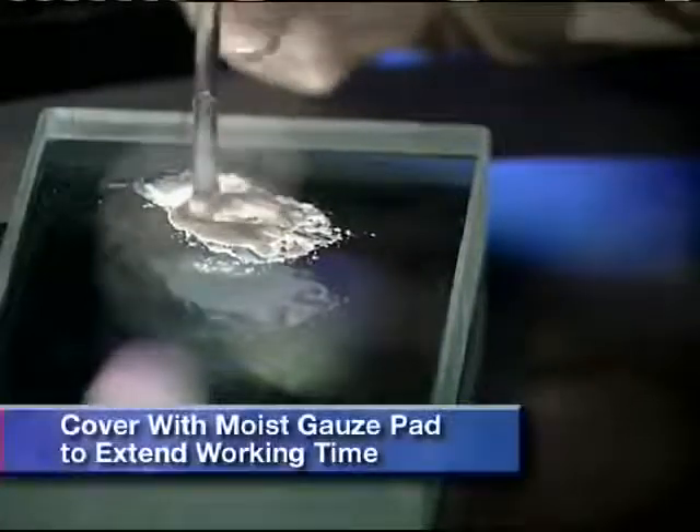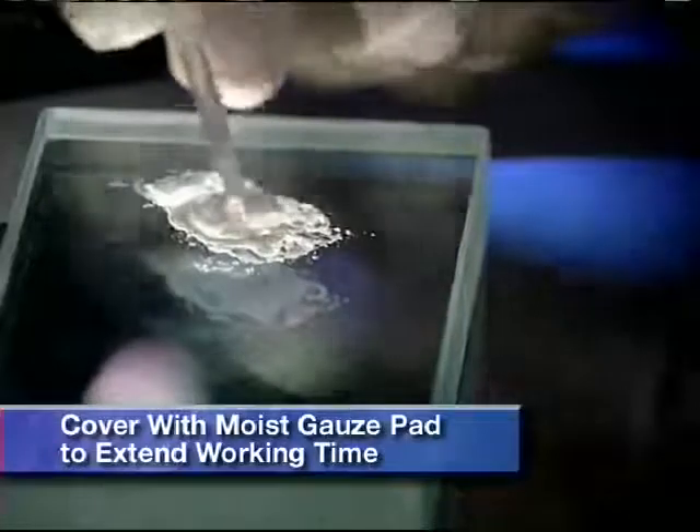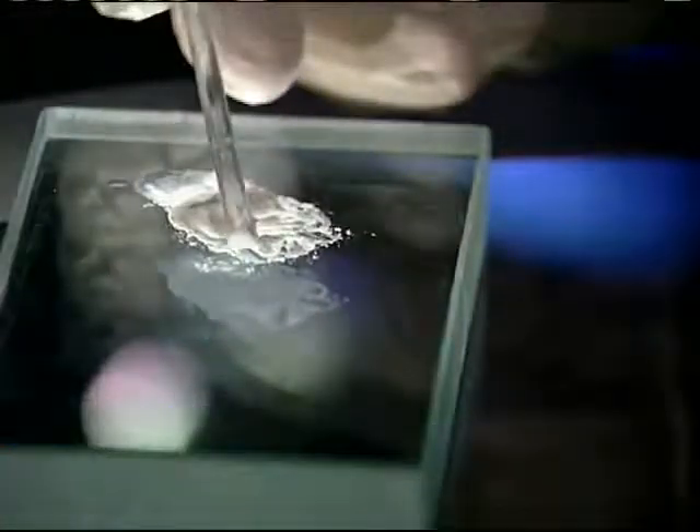If you desire a longer working time, cover the mixture with a moist gauze pad to prevent evaporation.